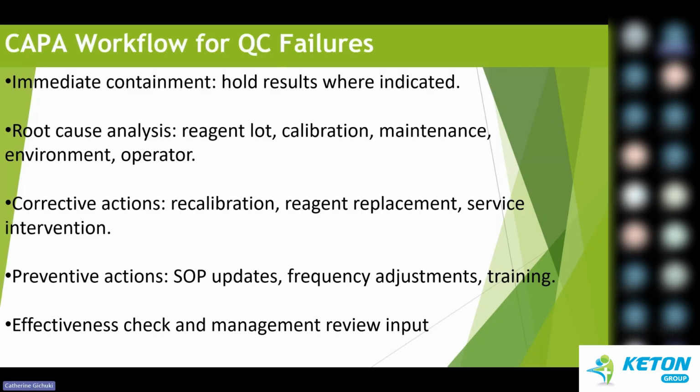Then you want to fix that problem, the corrective action. You want to fix the problem by taking an immediate action, such as recalibration or reagent replacement. Then maybe service intervention or environmental factors. If it was an environmental factor, maybe the AC was off or is not functional, and the temperatures are way too high and it's affecting results. So you want to correct that, or you want to call for service intervention, service support, all that.